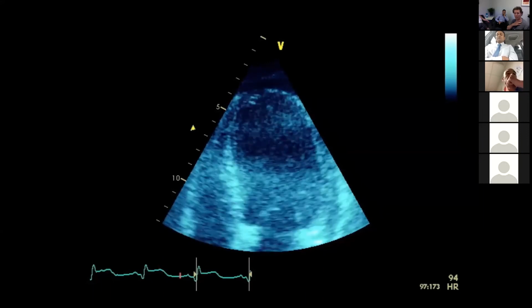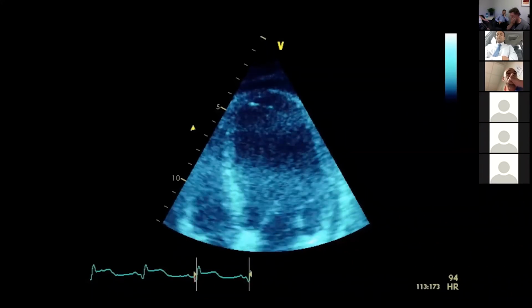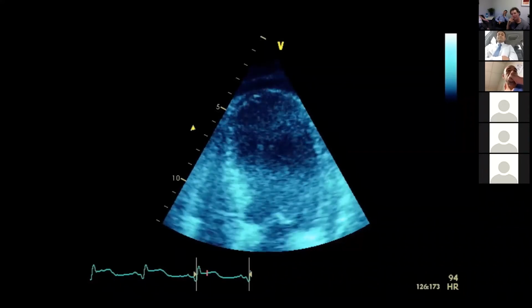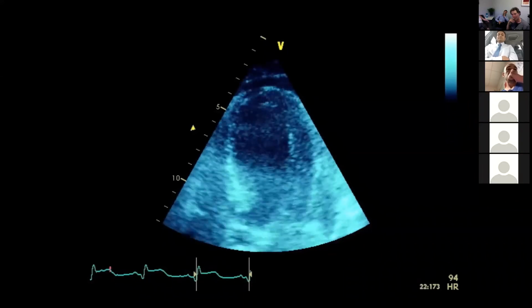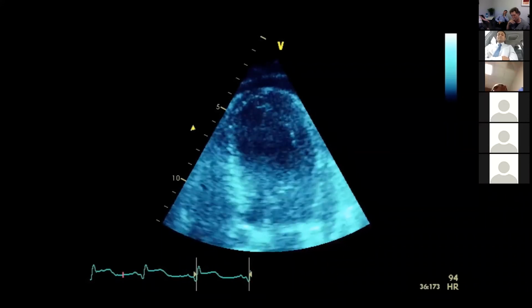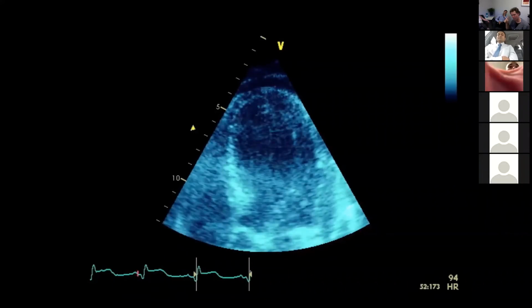Yeah, exactly. So basically, it's a focused view of the left ventricle of the same patient in an apical four-chamber view. And this is trying to demonstrate whether there are any filling defects across the apex and the apical contraction. So definitely the apex is akinetic, is not moving. I can't see any big filling defects. So probably I'd consider either a contrast study or at least placing color flow across it, and as well pulse wave Doppler and identifying the flows.